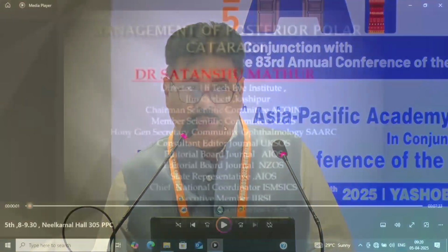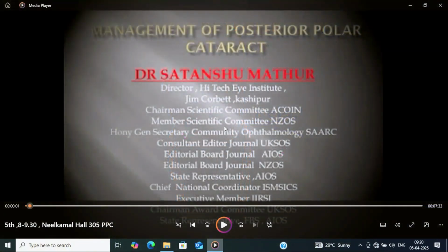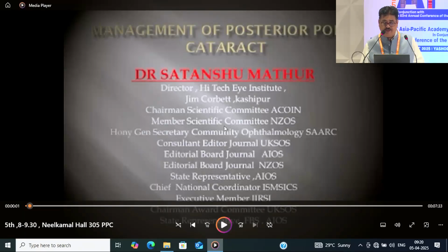Thank you all the organizers of this conference. Posterior polar cataract is an entity that is always a headache even for the specialist phacosurgeon. But if we follow simple tips and tricks, we can achieve a high success rate even if there is a pre-existing break. I am just showing two videos.